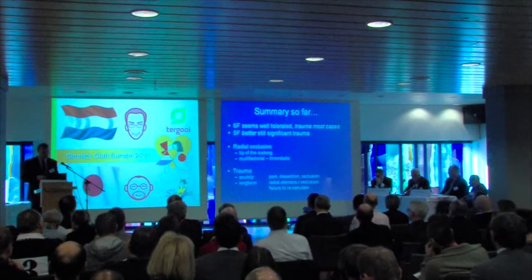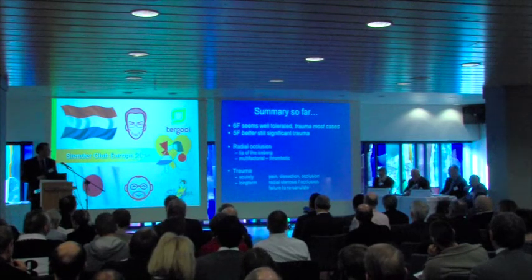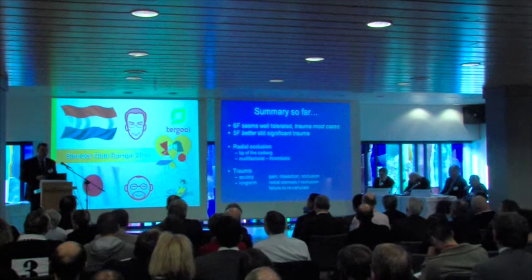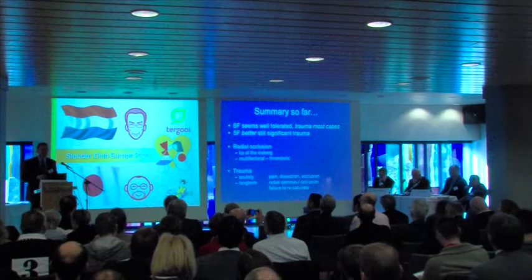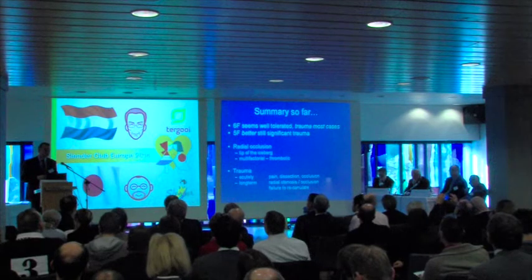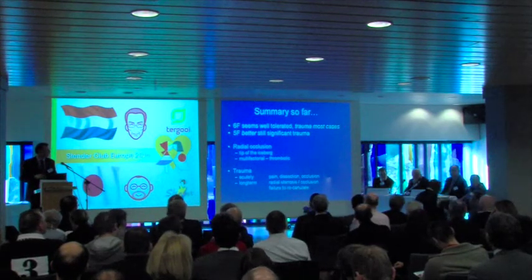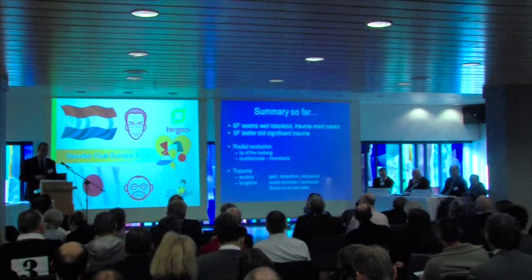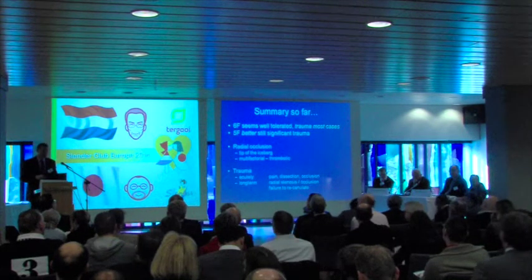So we're actually causing a lot more trauma than we think with 6 French, and I'm sure 5 French is better, but perhaps not good enough. And that's why I'm very pleased that Ferdinand and colleagues are arranging this meeting so that newer techniques to reduce things further can be investigated. I would try to say that radial occlusion is the tip of the iceberg, and there's a lot of non-occlusive injury that's occurring that we need to be thinking about and investigating.